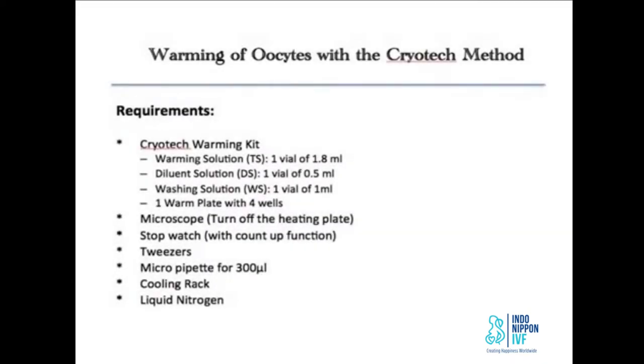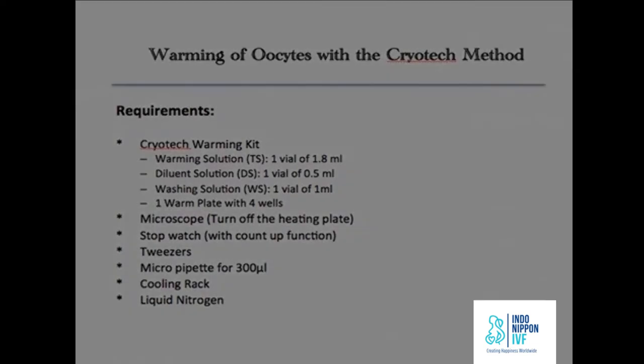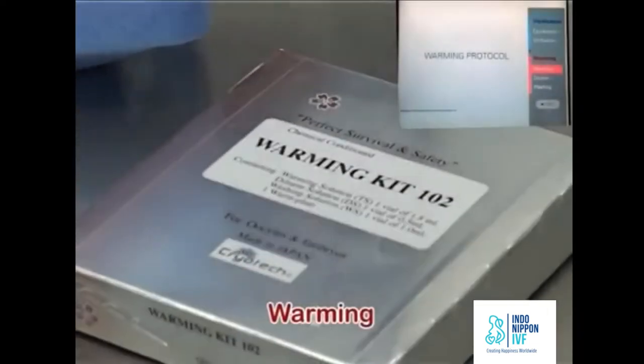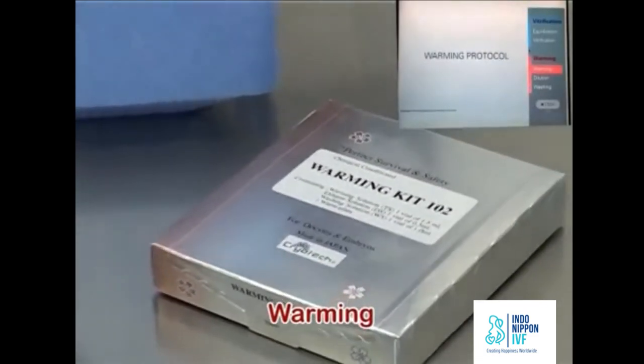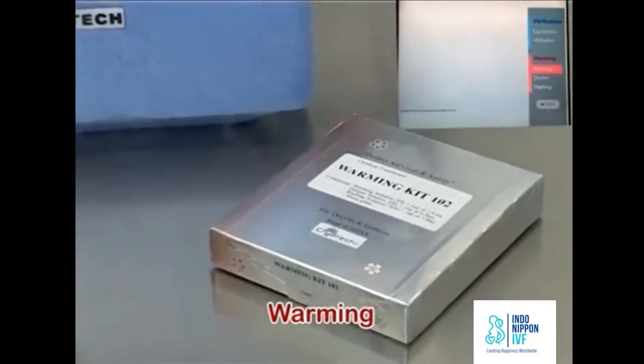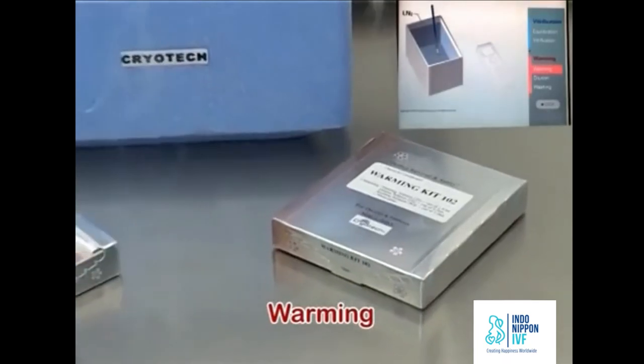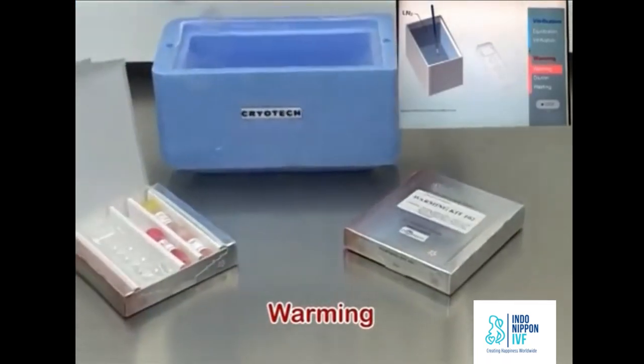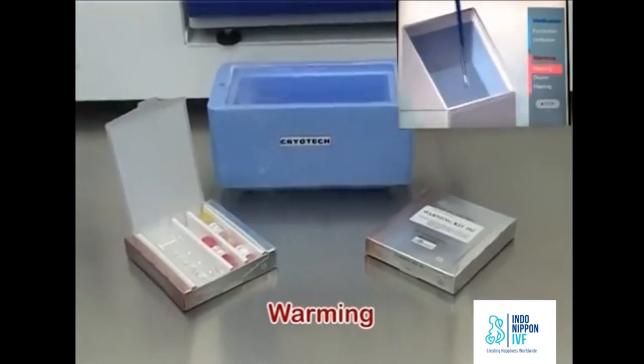The warming process. Before beginning the process, ensure that the microscope stage heating is turned off. Use a pipette that is the right suitable internal diameter to optimize the dilution of the solutions to get a high survival rate after warming. Place the warm plate and TS vial with cap in the incubator at 37 degrees at least 4 hours before warming. Overnight storage is recommended. Bring DS and WS vials to room temperature of 25 to 27 degrees centigrade at least one hour before warming.